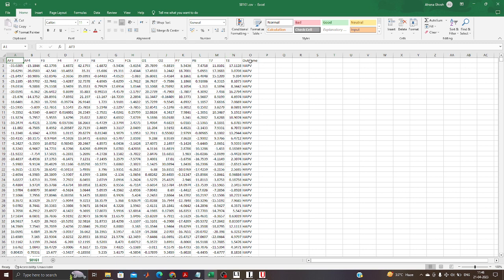And outcome is the class label actually here. Whatever the user processed with emotion, like HAPV means high arousal positive valence, HANV means high arousal negative valence. This type of class labels were there, but now we are not concerned about that because we will be just processing this particular EEG data. That means without the class label, we will be selecting channels from this particular set of channels.